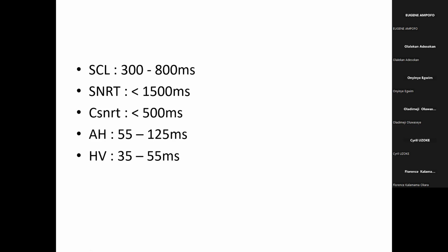Okay. So the sinus node recovery time helps us to know the functional property of the SA node.